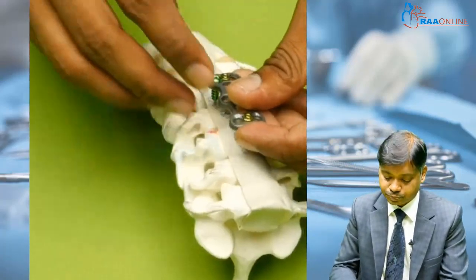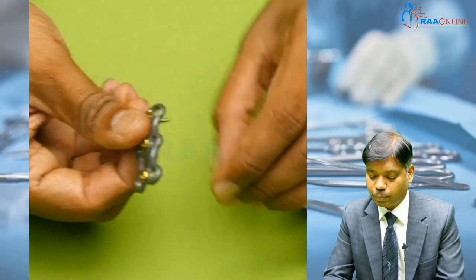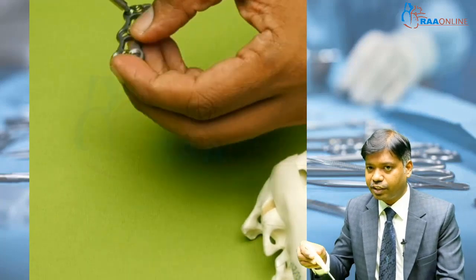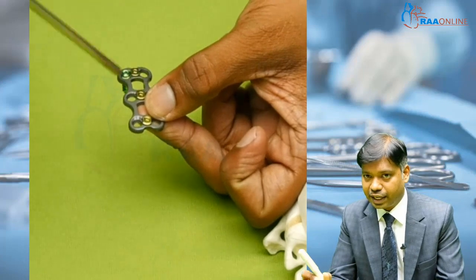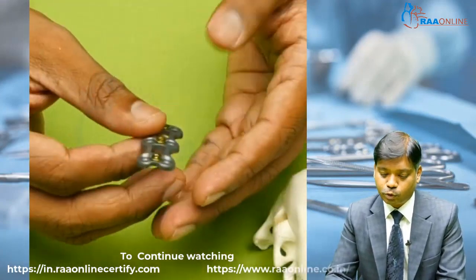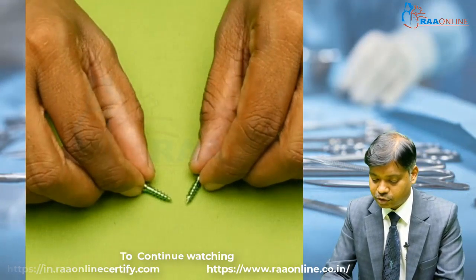The direction in which you have to insert an anterior cervical spine screw is the medial direction. Suppose you are placing the plate like this, the direction should be like this, because the medial direction will give you a better hold. You can see the direction of my screwdriver. Medial direction will give a better hold because of the triangulation technique. The bone between the two screws on either side will be more, and it will resist the pull out of the screw. So basically you will be inserting the screw like this.